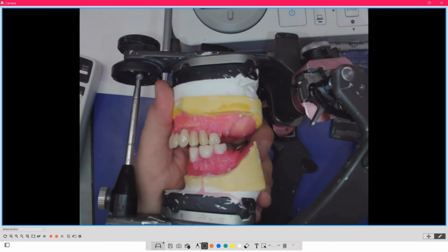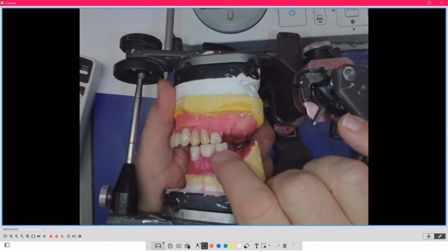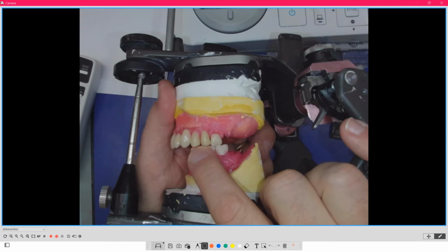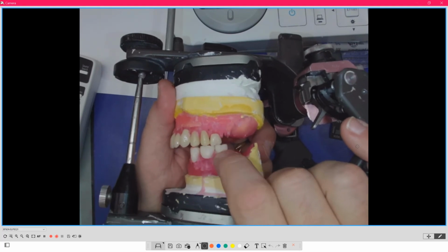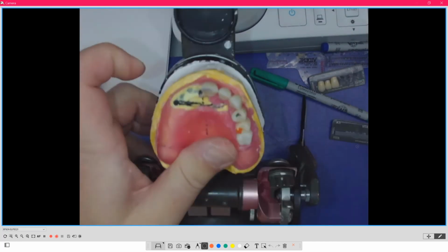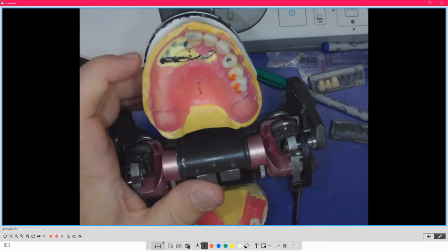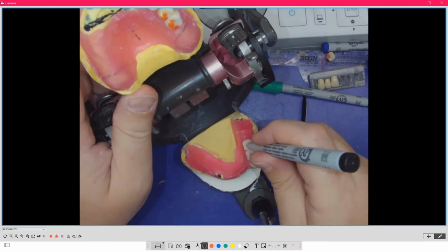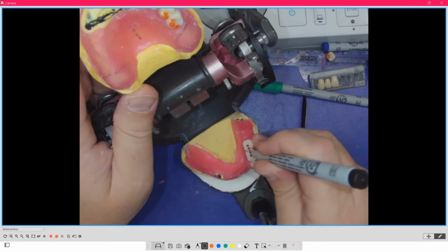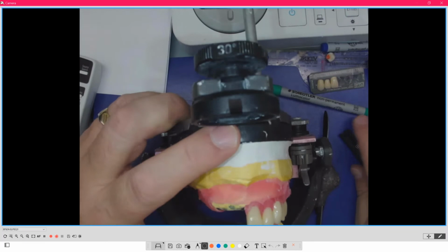And I'm showing that to you because, of course, what I do here clinically, or what I do here in the lab for you today in the demonstration mode, you may pick up your next class 2 and it's a lot different. But what I'm showing you is don't be scared, because now you can put whatever tooth over whatever tooth, so long as you're keeping in mind that you are putting this fossa into these bowls. And it doesn't matter because there's a bowl, they're all over the place. Okay? And that's how it was designed.